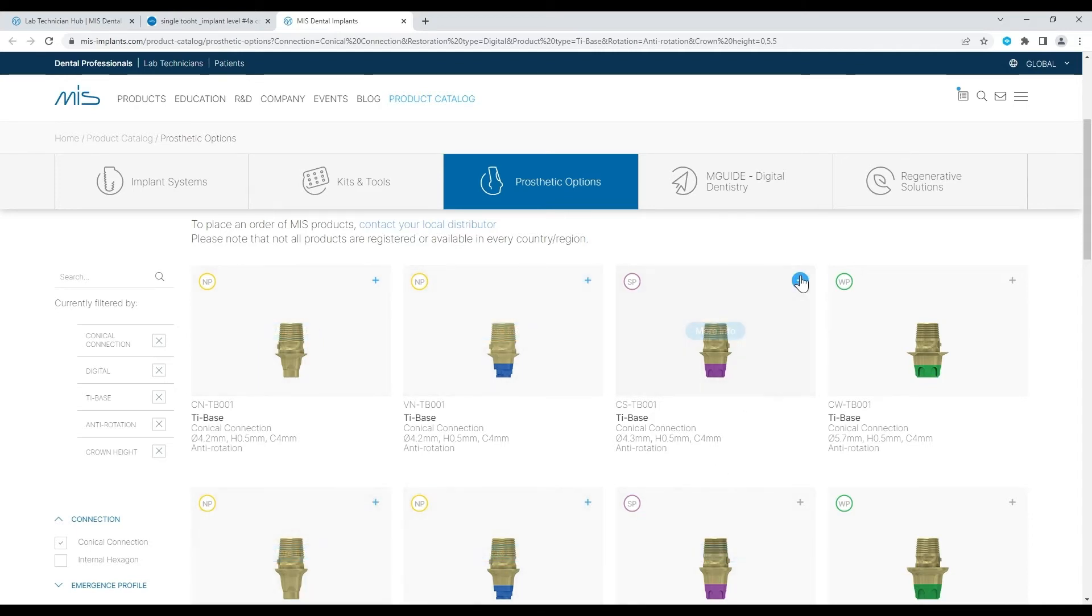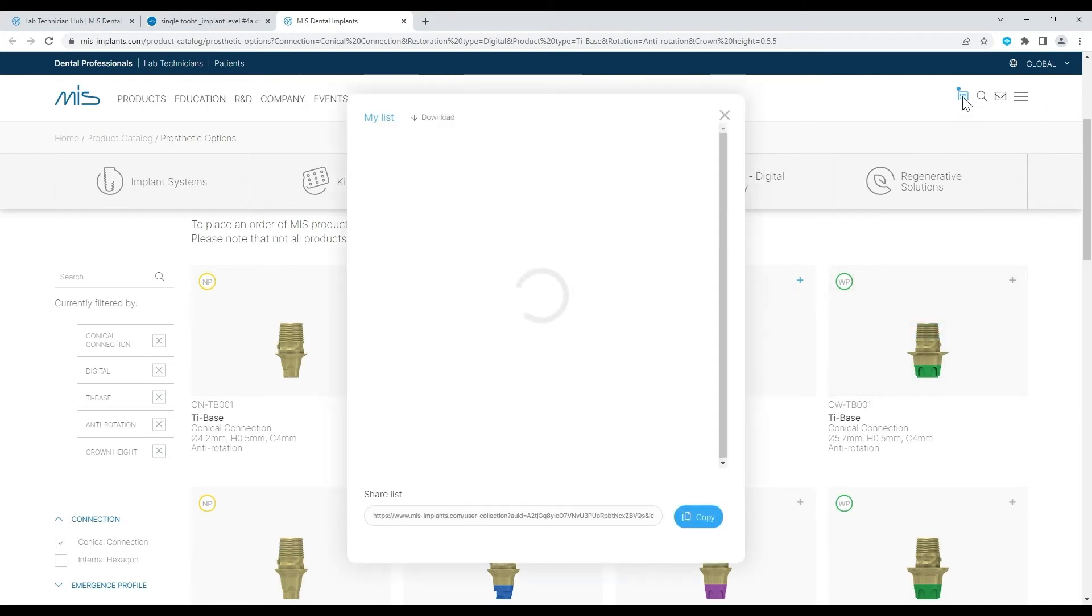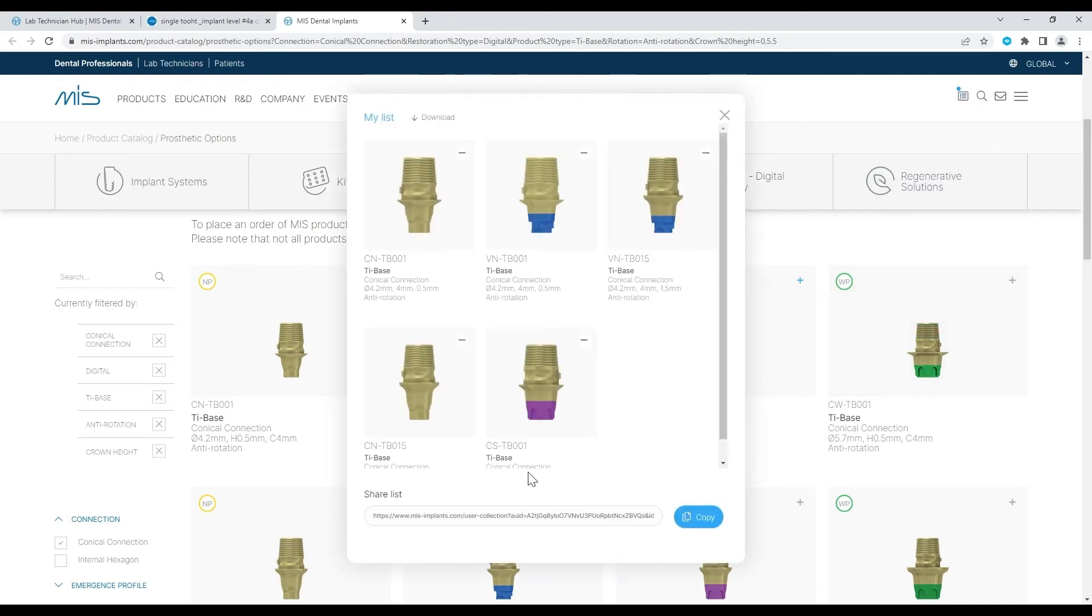When you're done, view the list by clicking on the list icon on the top bar of the website. You may share the list by copying the link or downloading it as an Excel file.